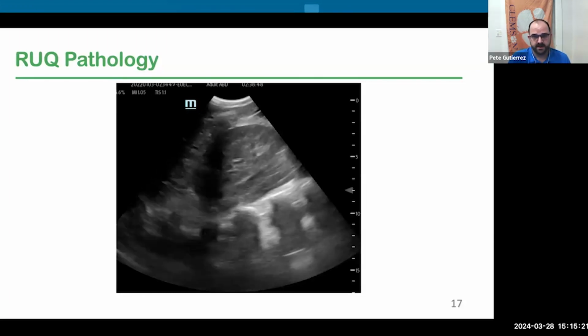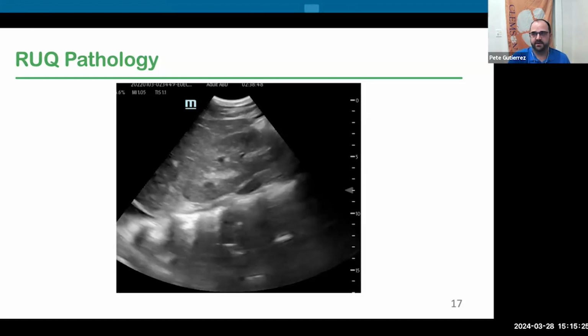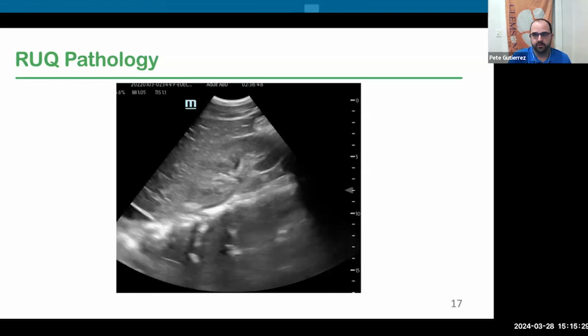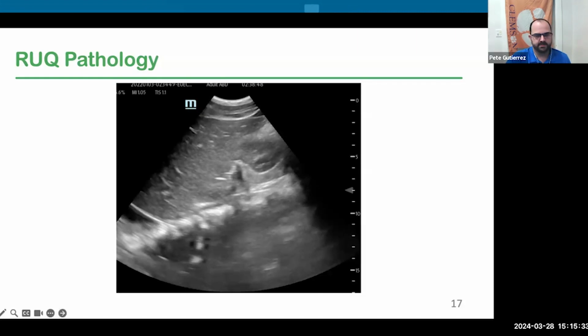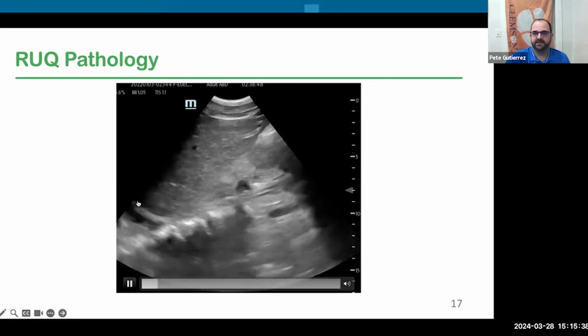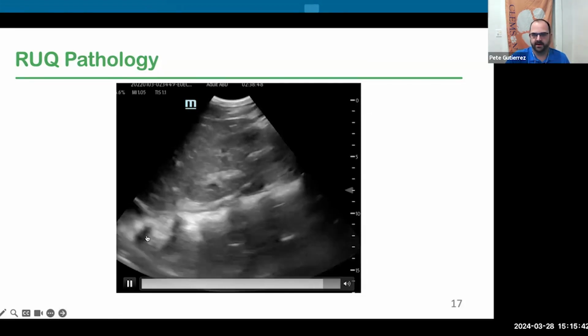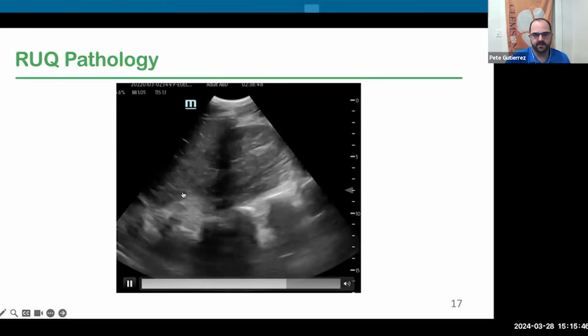This image here illustrates the spine sign, which is indicative of fluid in the hemithoracic space. In normal upper quadrant views, you can only see the lateral aspects of the vertebral bodies as it comes up to where the diaphragm is right here. The reason is because there should be air-filled lung that is directly on the other side of that diaphragm, and air obscures the ultrasound beam, so you shouldn't be able to see anything past it.